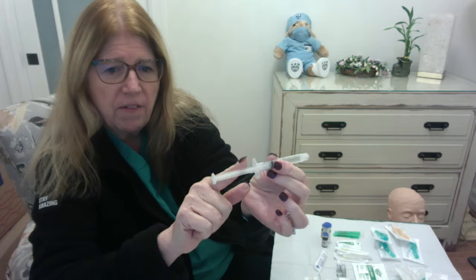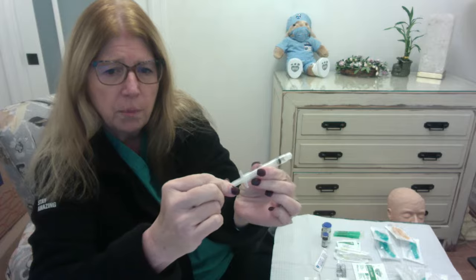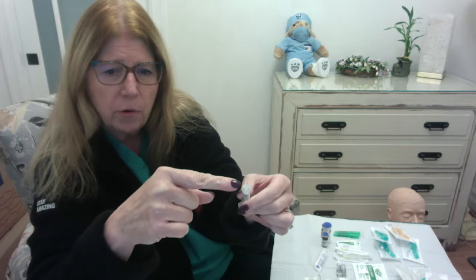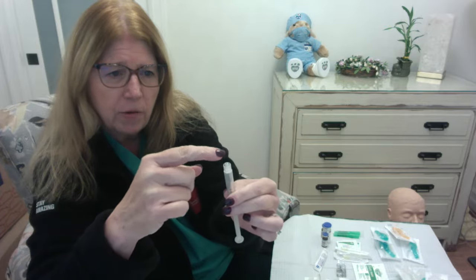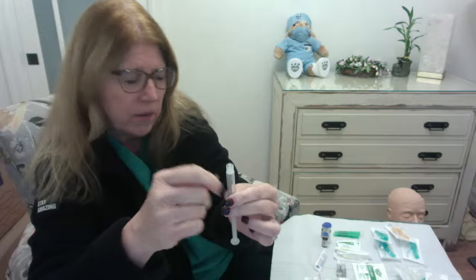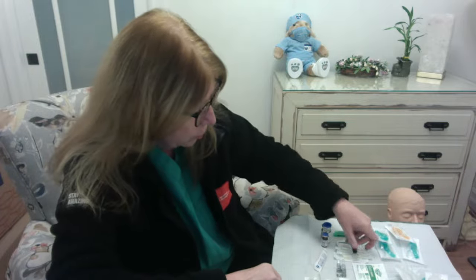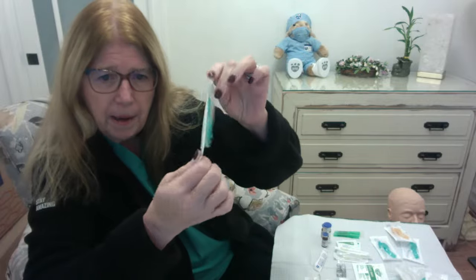We want to keep our fingers off the plunger and just use this round circle at the end to move the plunger in and out. We also want to keep our fingers off of the connecting port up at the top, so no contamination of this. And then, of course, we have various size needles, which we'll talk about sizes when we get to the injections, but needles come in separate packages, right?